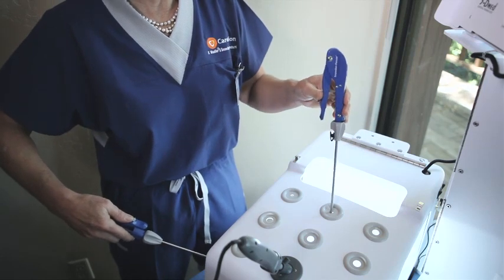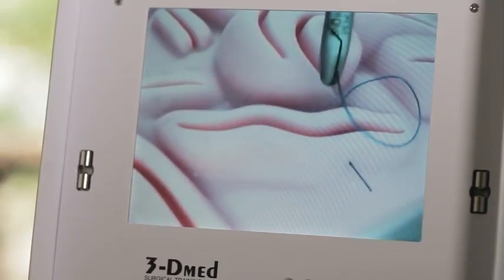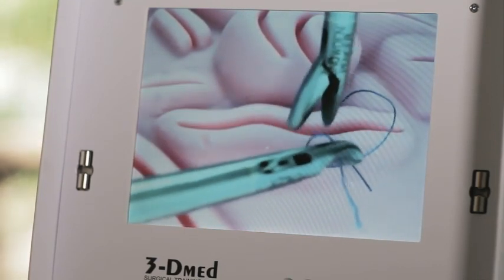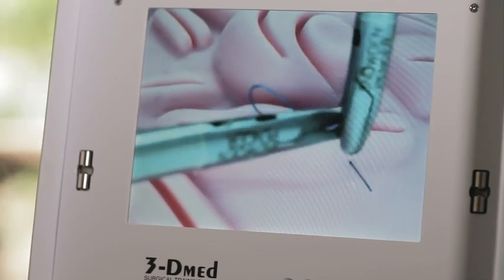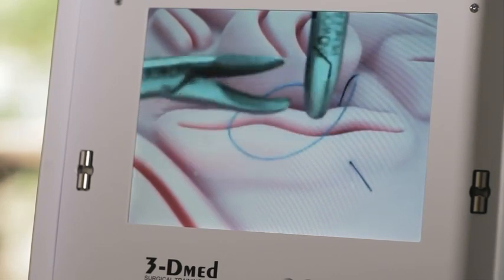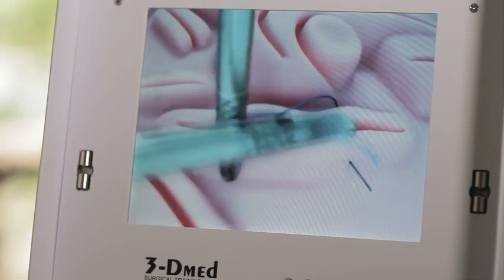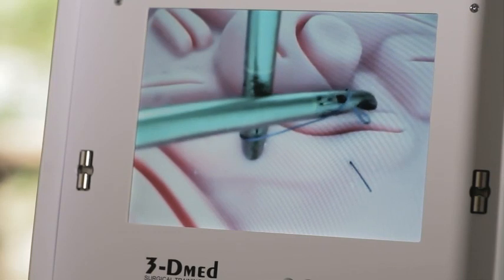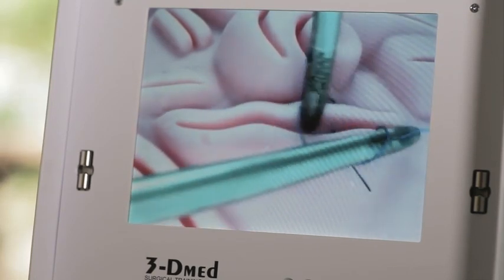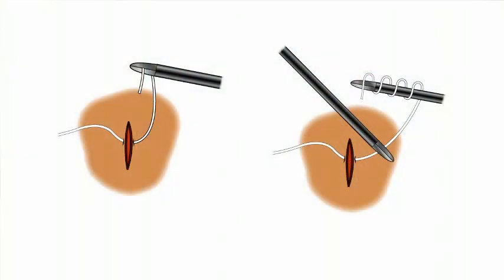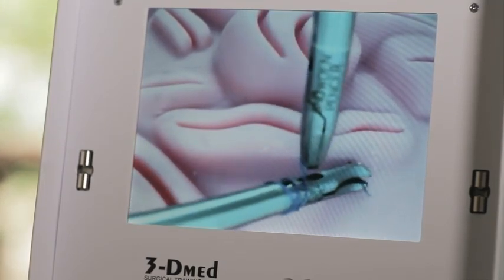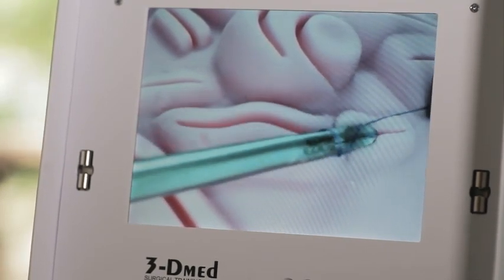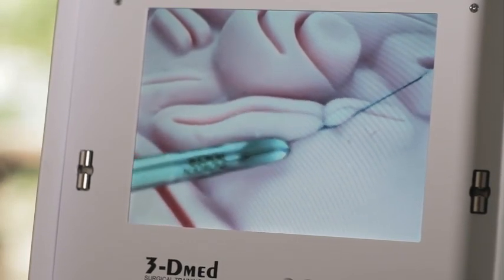In this segment, we're going to deal with what happens when your needle breaks off because it's going to happen. I'm going to pick up the tip of the long suture end and hold it in the needle driver with a very short end that's going to be easy to pick up. I'm going to hold the excess suture behind me and wrap the suture onto the needle driver. I'm going to hold it back so it wraps well above the loose end. Then I'm going to pick up the loose end maintaining my wrap. I'll pull it back up and we will travel together and pick up the loose end. We'll hold it close to the knot and tie it so our knot is not lost.